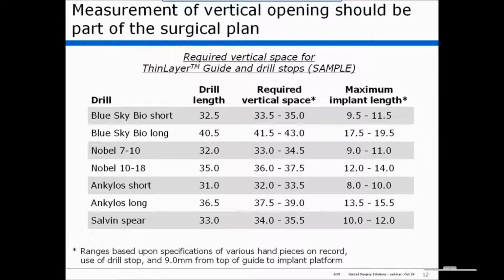And so, again, this should be all part of pre-surgical planning. And in my experience, it has not been part of pre-surgical planning. And I think that's why in a number of these cases, the guides are discarded because of lack of vertical clearance, because this was not worked out ahead of time.